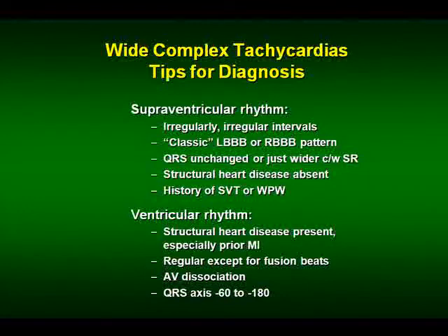Even when I walk into our surgical intensive care unit and our general medical intensive care unit, it's more and more common for me to see pacing spikes all over the place, and people have defibrillators. And if you deal with people who are sick and you deal with elderly patients with heart disease, you're going to see people with devices, so you have to have a systematic approach.